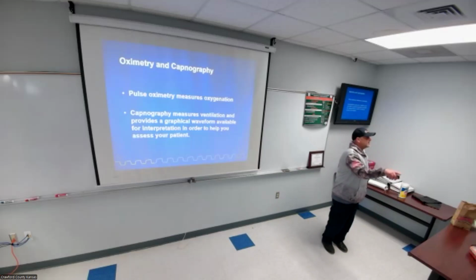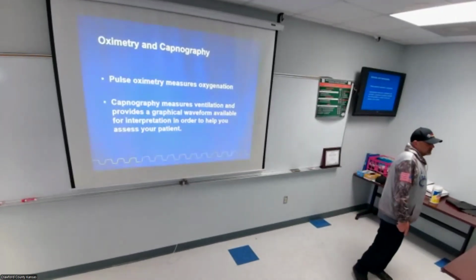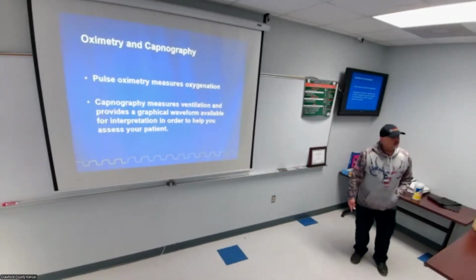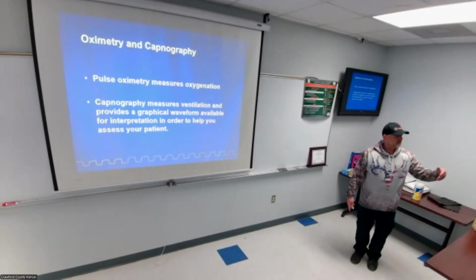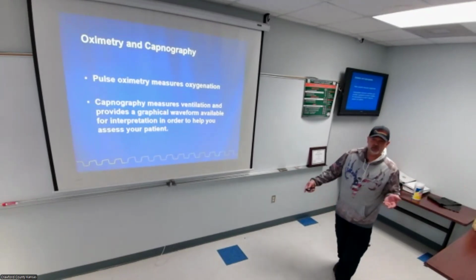Now, they can be hyperventilating if they're not moving any air, if they're air trapping secondary to COPD, emphysema, asthma, something like that. You can also increase your CO2. You get your little short burst of air where you're breathing 40 times a minute, just not doing you any good. Hypoventilation, usually, especially in people that are unresponsive, is the correct answer, secondary to they're just not moving enough air.